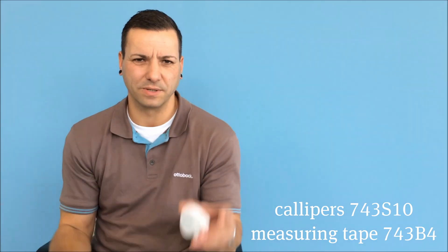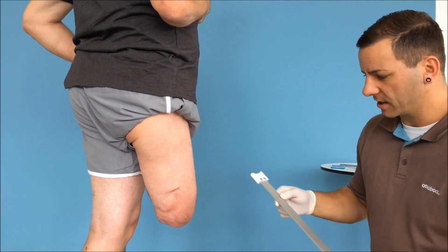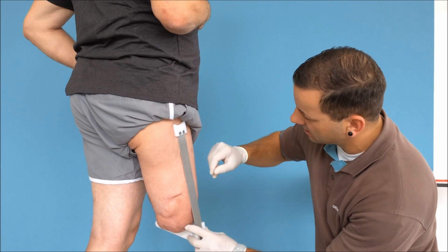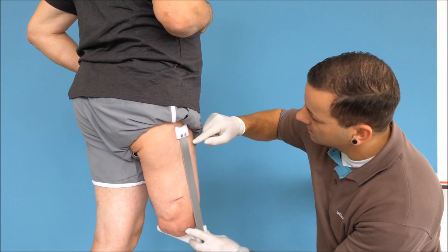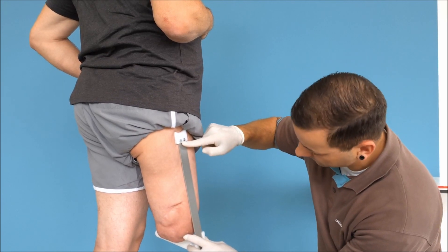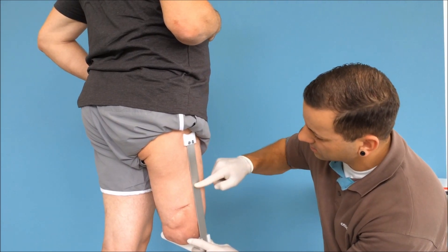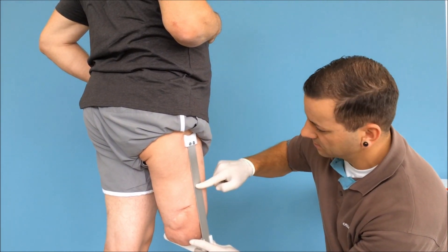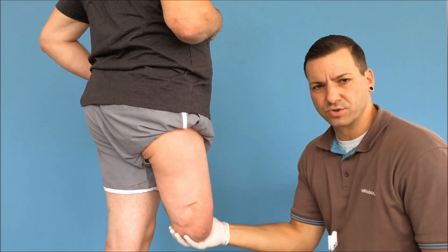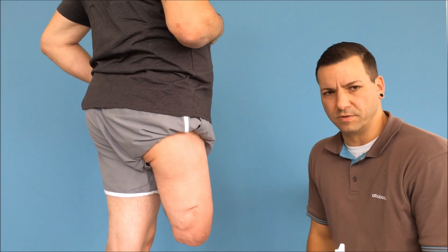Next we measure the circumference using the preset calipers and the 743 B4 spring tensioned measuring tape. The length of the residual limb is still set and we position the calipers on the lateral side of the thigh. We mark the first measurement three centimeters below the ischial tuberosity, then five centimeters from the distal end and a measurement in the middle as well. We take three measurements even if the residual limb is long and has a consistent volume; for more complex ones we would take four or five.